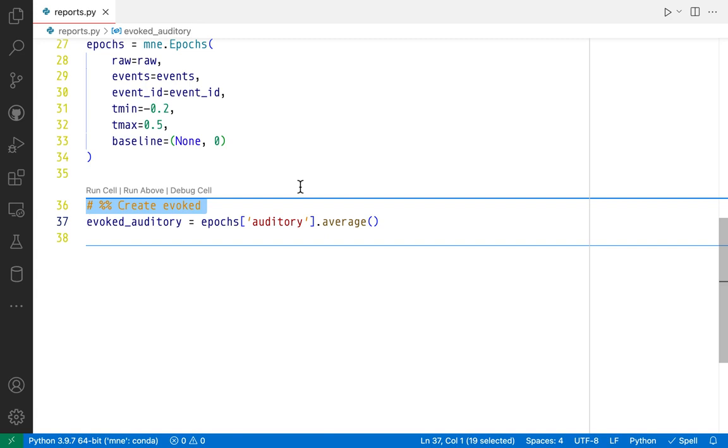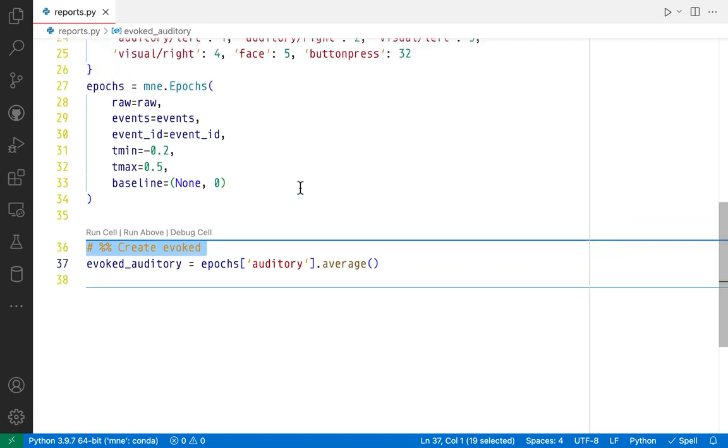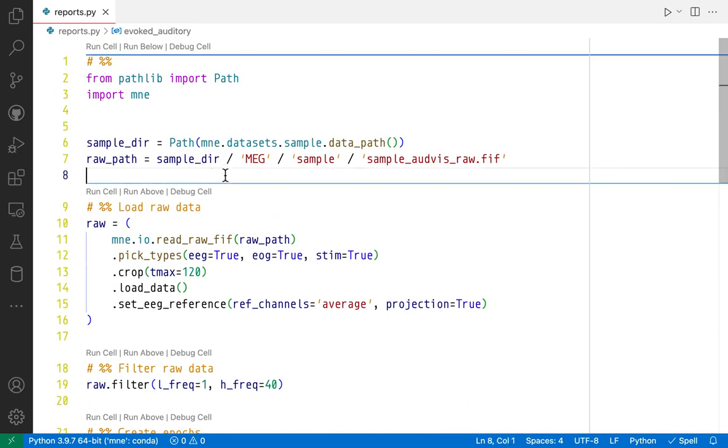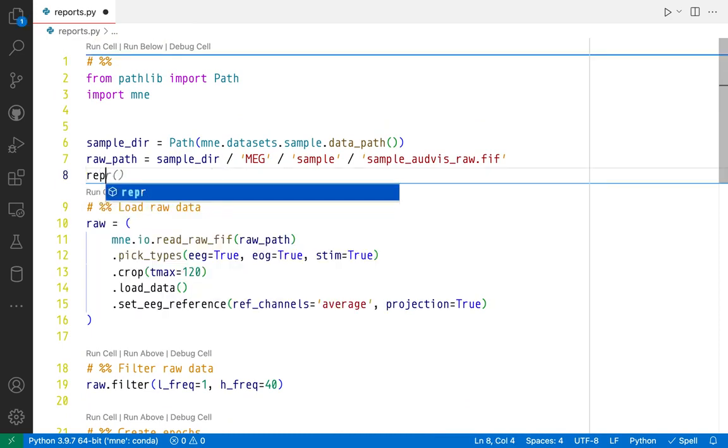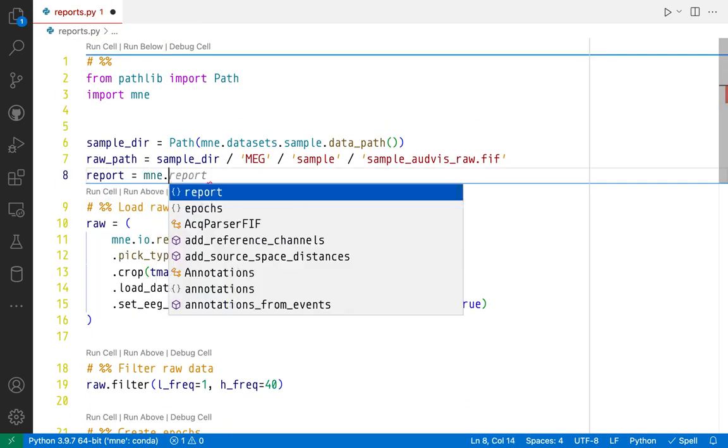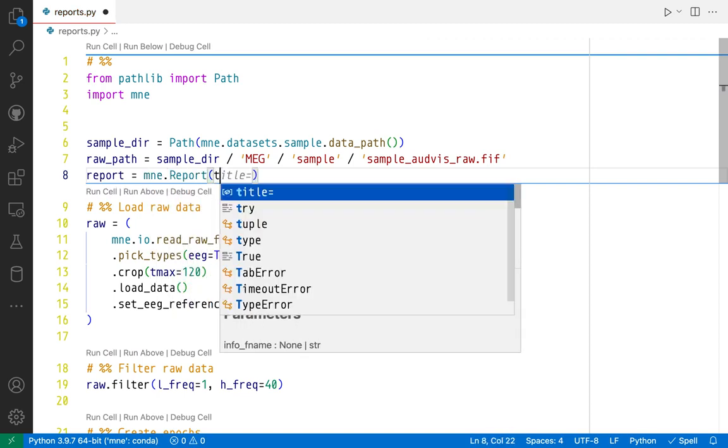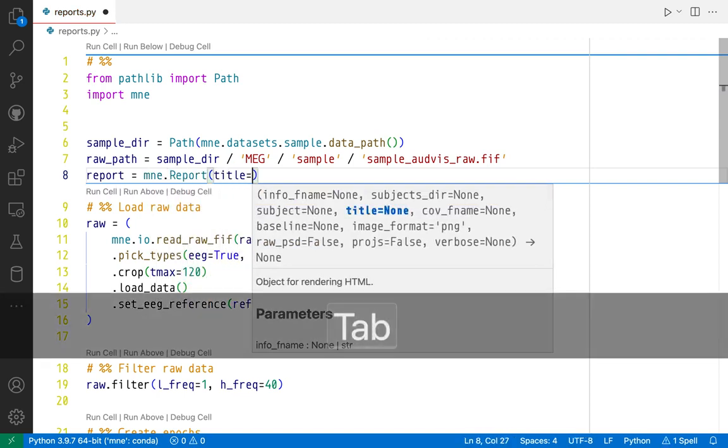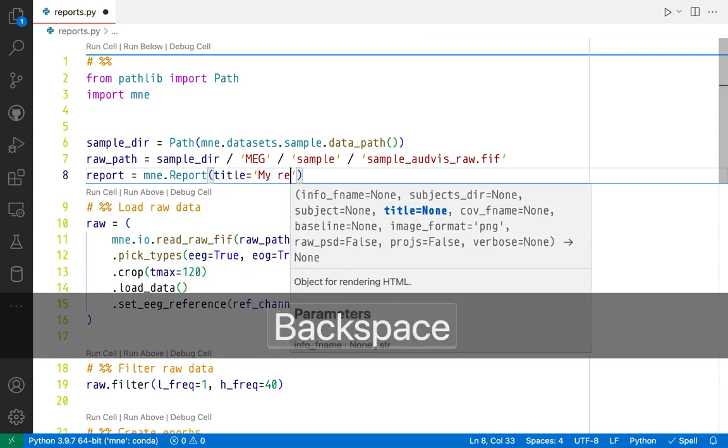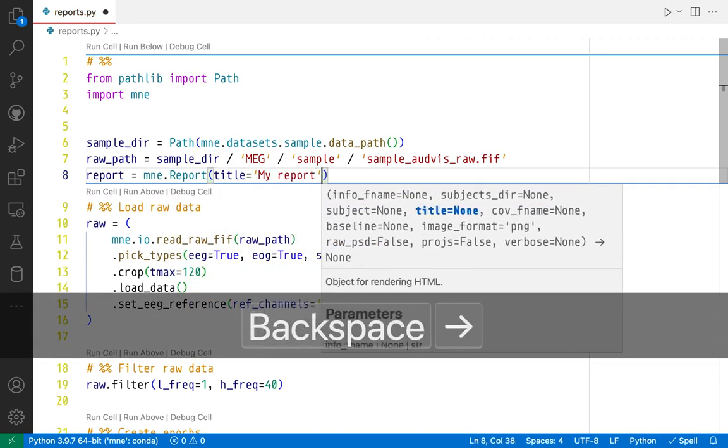Now I want to show you how convenient and simple it is to use an MNE report to document the results of each of these processing steps. First we're going to create an empty report from mne.report. I'm going to give it a title, it's going to call it my report.